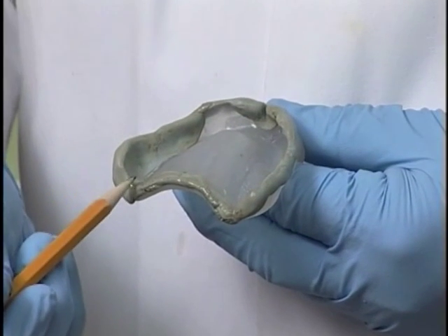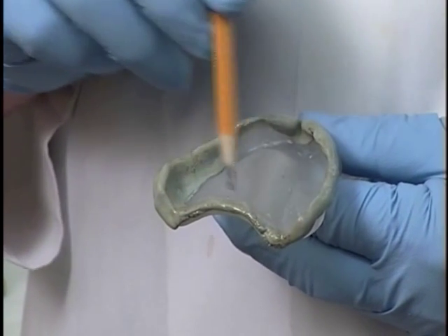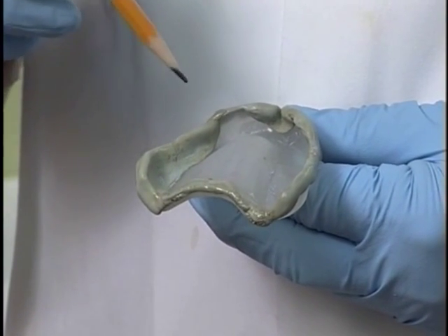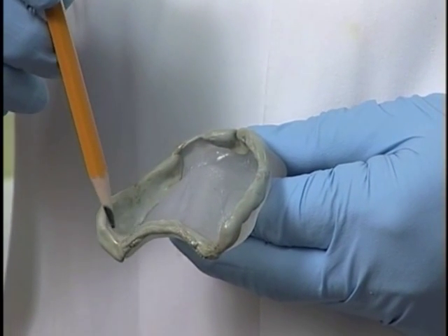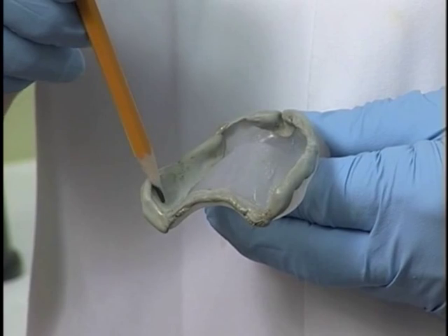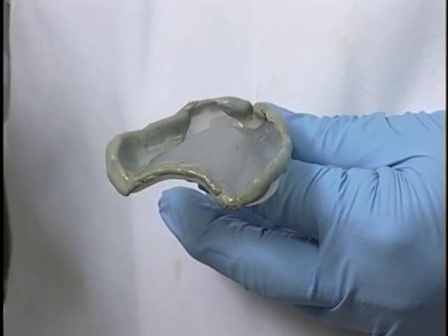Across the posterior from hamular notch to hamular notch, we have displaced some tissue by adding this compound in this area. Now what we need to do is to eliminate excess compound that may be in our border molding procedure, and we can see that this has a fair amount of excess compound in this area where it has creeped down on the inside of the tray. So we have a fair amount of that excess compound here.